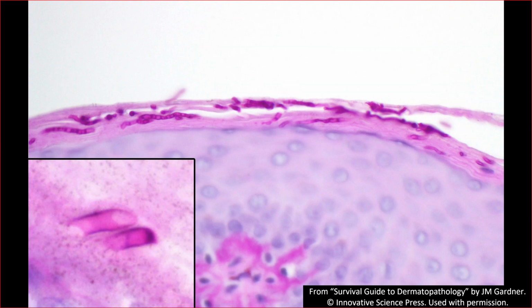If I tell you in my report, well, there's some pink stuff and I'm not sure if it's fungus or not, you may not be real happy with me. I have occasionally done that and said, I'm a little worried, but I can't be sure, and I want you to scrape it or culture or something like that.